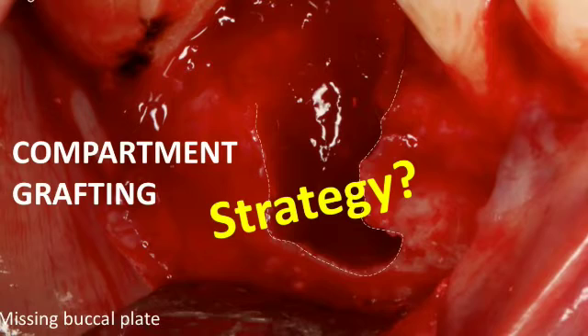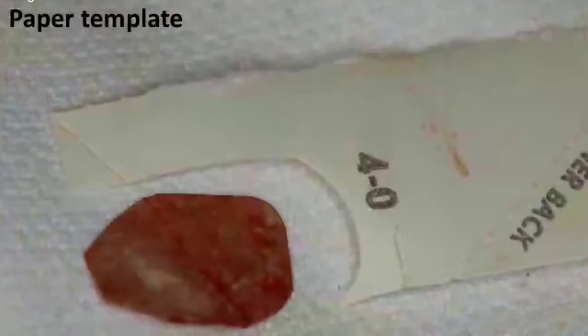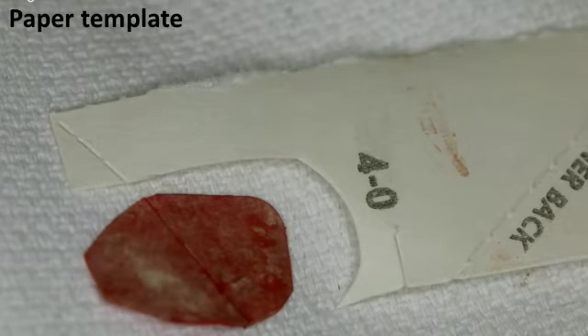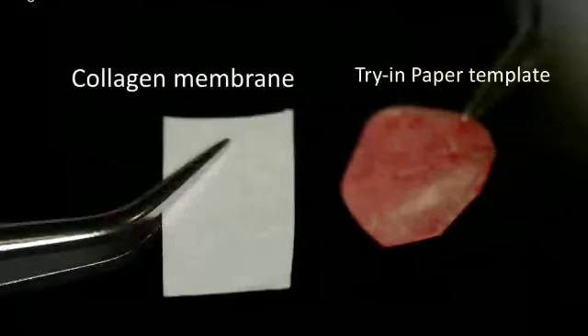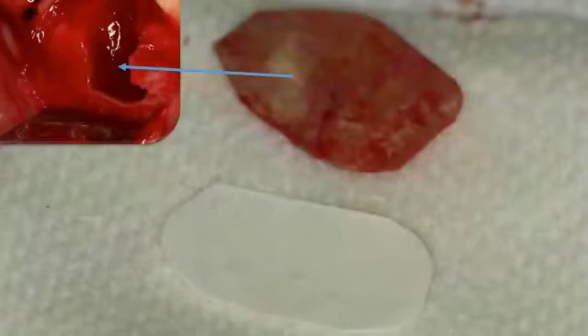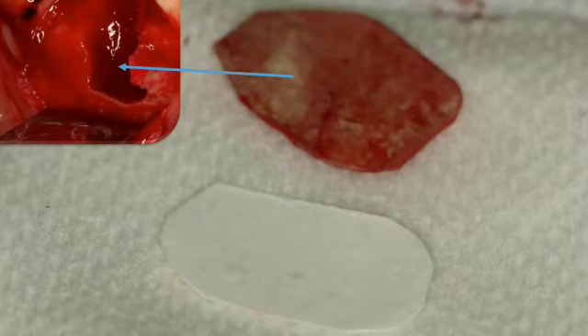Once you put the membrane in and take it in and out to finalize the size, it will get hydrated from blood and saliva and become less stiff. A useful trick: use the paper inside your suture material packaging, cut a template from it, and use that to adjust the shape. Once you reach the right size with the paper template, place it next to the actual collagen membrane and shape it the same way. Then place the collagen membrane — it fits perfectly because it's based on the template.